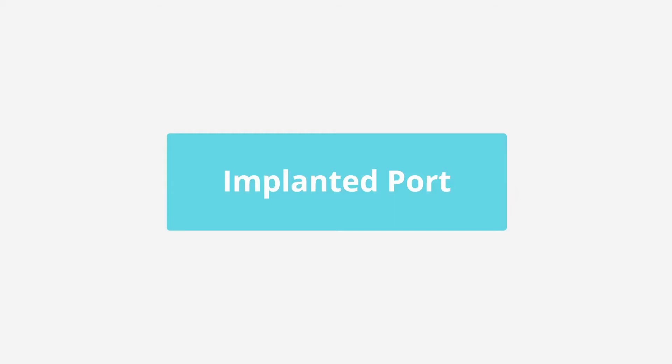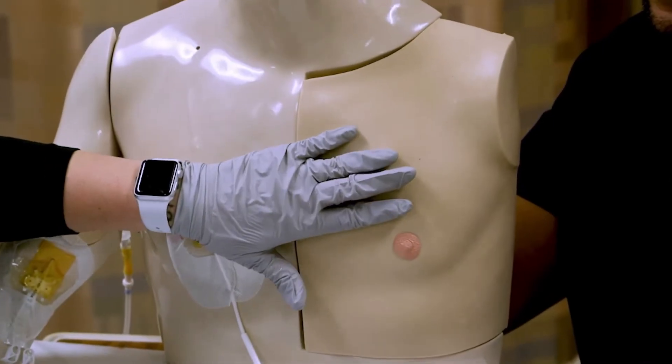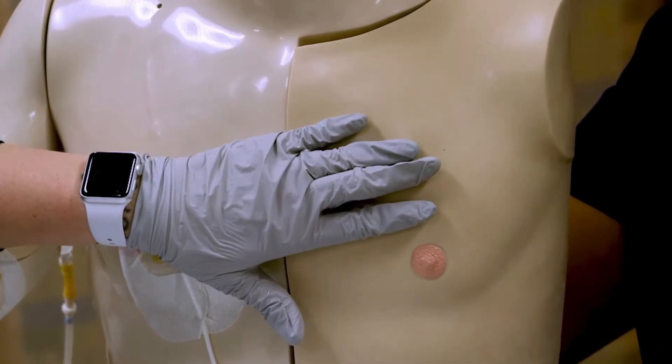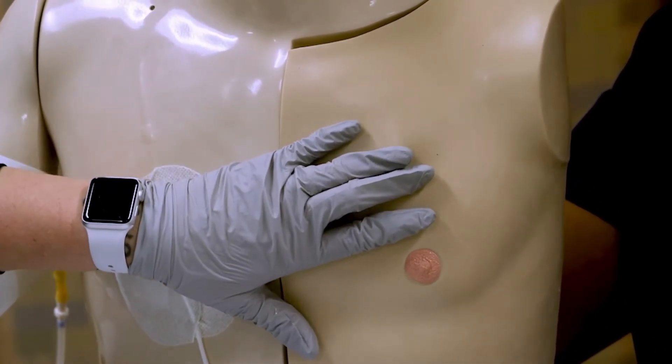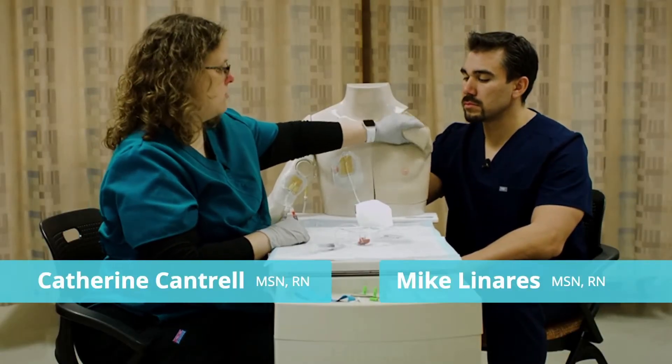Now we're going to access a port-a-cath with a Huber needle. So Kat, take it away. I could show you how to access this through the skin, but that's not going to help you very much visually if you've never worked with a port-a-cath. So I'm actually going to take the skin off.